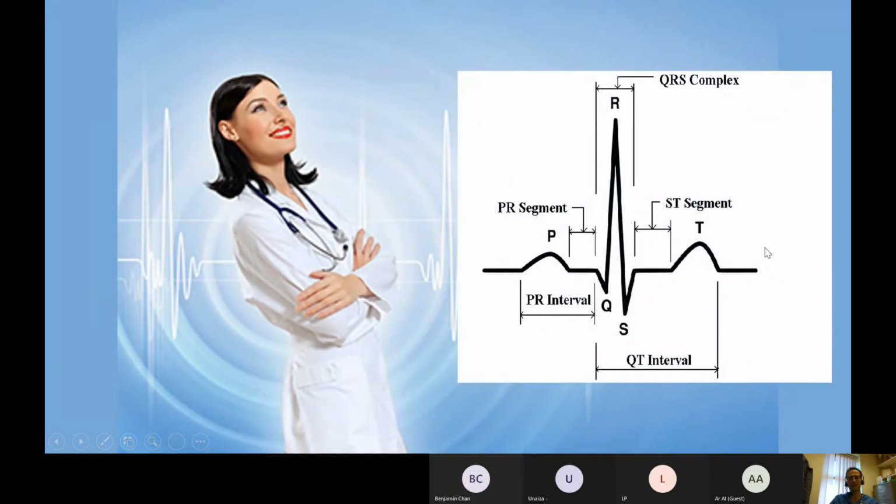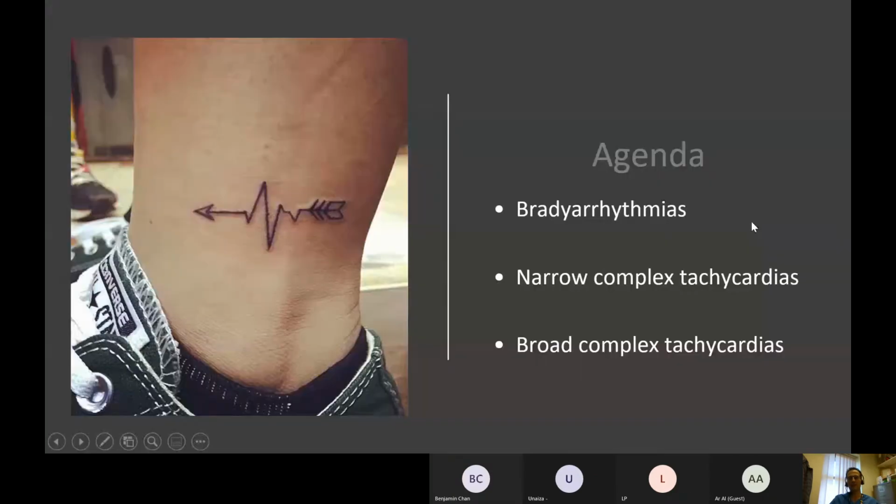And I want to turn you from this gentleman. You can imagine an ECG screwed up in this furious hand and take you to the promised land of happiness and synergy with ECGs. And if nothing else, I want to ensure that if you do get a tattoo, you do not end up with this electrically inaccurate ECG, which maybe looks pretty but is totally wrong.